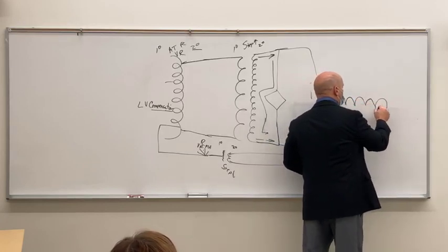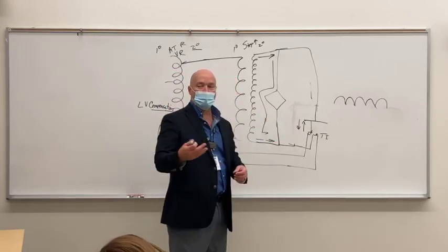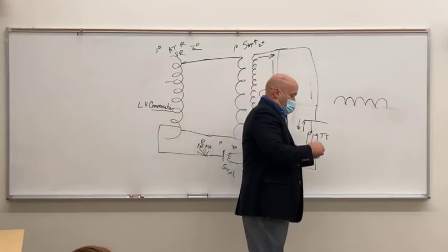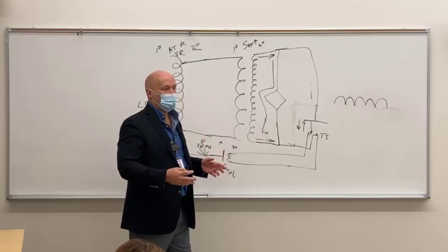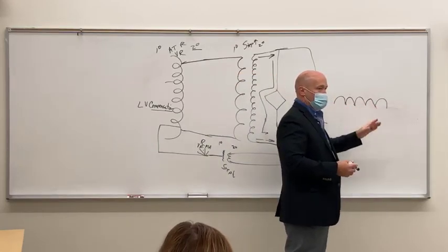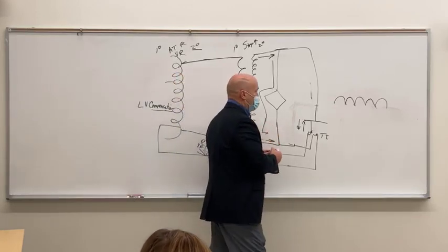This is, in comparison, full-wave rectification, because you're using the entire wave. Right? So that's, again, what you're going to be using if you ever work with a single-phase machine. That's what you're going to be using, full-wave rectification. So the power company can supply what we call three-phase. And with a three-phase generator, three-phase power supply, what we get is not just a single set of pulses like this. We still have to have alternating current all the way through this. So we've got three different pulses running through all this at one time.